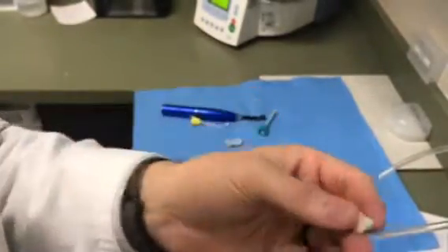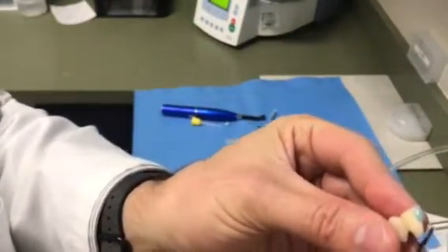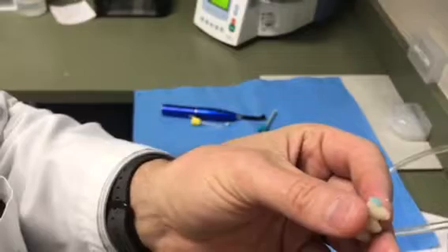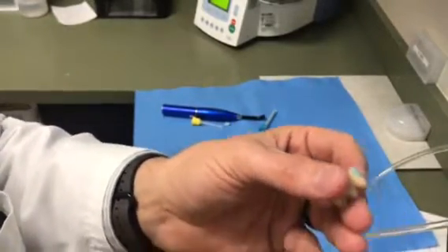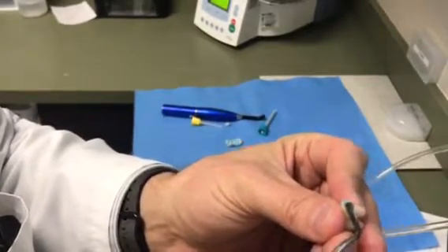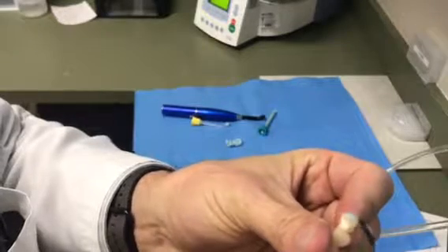Where this method is especially helpful is on an implant case or something where you need some pretty dramatic changes to your gingival embrasures. If you just send it to the lab with a generic note of, hey, close my gingival embrasures, there's a good chance that's going to fail, and then you're going to have a third and a fourth try, which starts to make us look bad. So on those kinds of cases, those are the cases where I'm going to use this method.